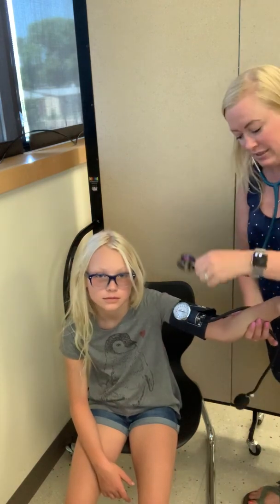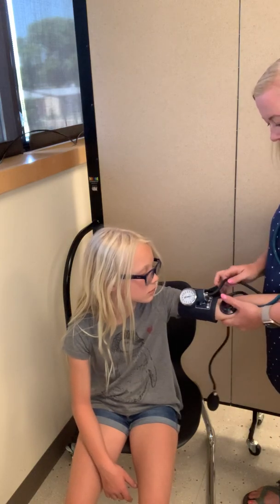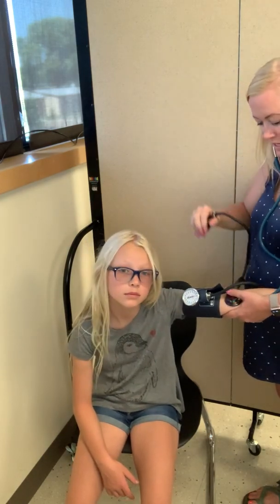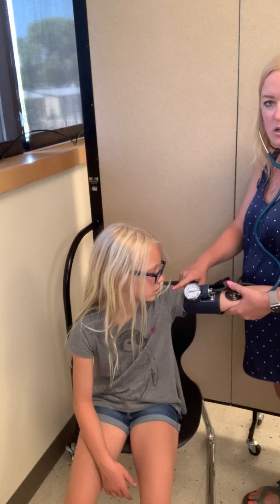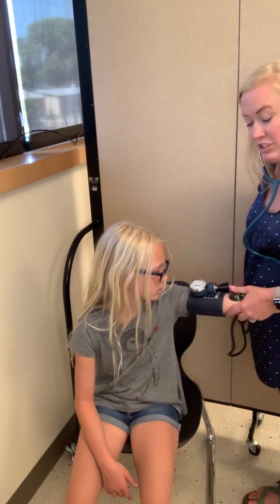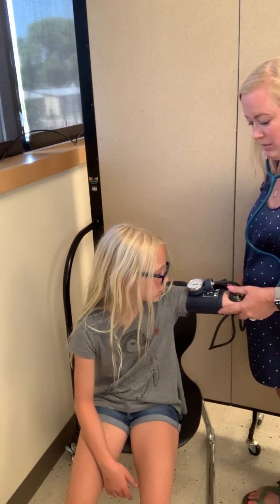So you're going to take your stethoscope and place it in the antecubital space right here of her elbow. And then with your right hand, you're going to squeeze the bulb up for the air chamber. You also want to make sure that you hold her arm above or at her heart level. So I'm going to squeeze it. For a child, I usually squeeze till about 130, 140, because they typically have a lower blood pressure.